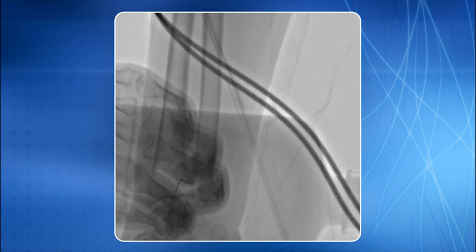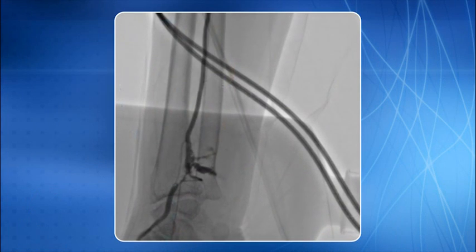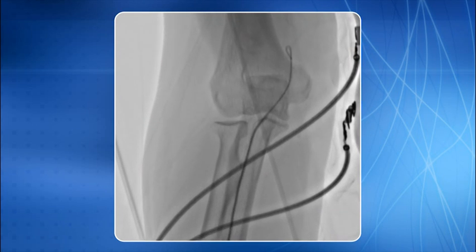This is another example of a low radial loop. Through the plastic cannula of the puncture needle, we are trying to negotiate PTCA guide wire which actually refuses to advance further. We then did a contrast injection through the plastic cannula which revealed a low radial loop complicated by perforation. We then punctured radial artery in the higher segment. The procedure was then completed in usual fashion.